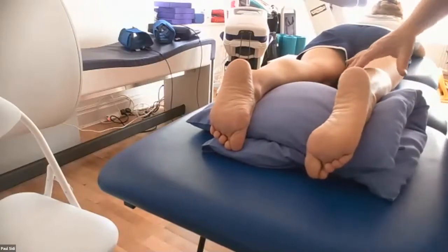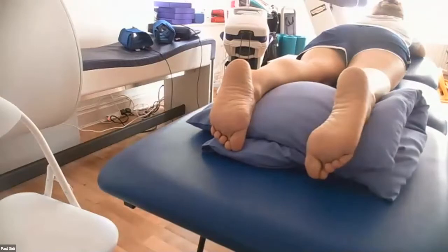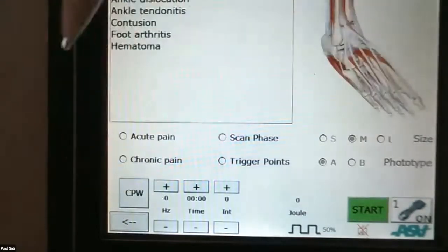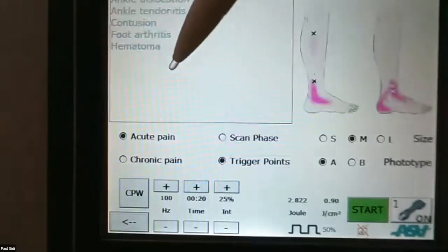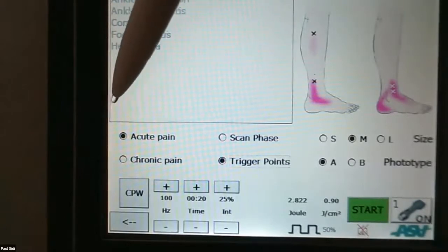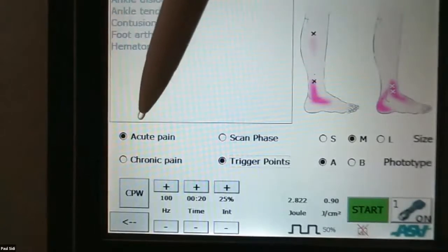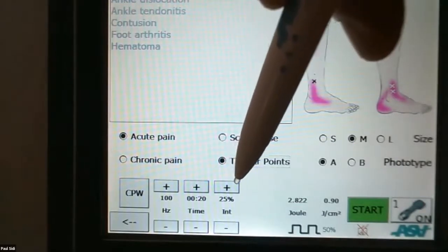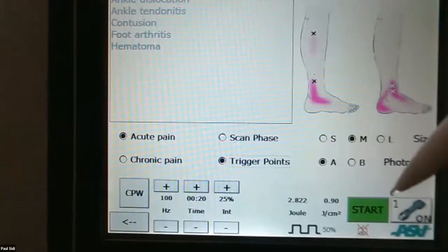What we can do is we can just set the trigger point setting. We just go on to back here. Just press trigger points. Okay. It says acute. Leave it acute because even if you've got a chronic condition, trigger points by nature are acute. Okay. It says 100 hertz, 20 seconds, 25%. Just leave it there. That's fine. Okay. Press start.